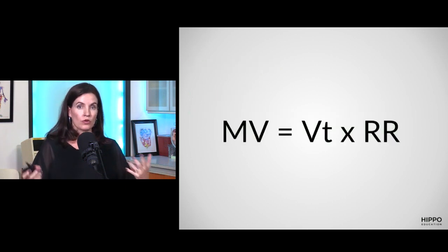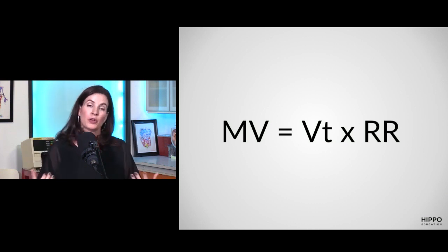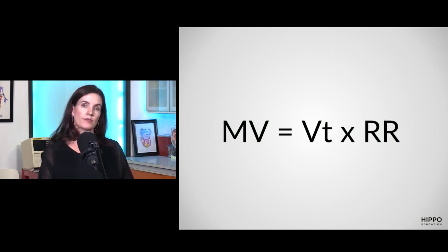Now, the way I remember this is the only formula I'm going to give you. And so if it works for you, you can remember it. But your minute ventilation is tidal volume times respiratory rate. And so when I think of people who need to blow off more CO2, I can remember that they need to increase their minute ventilation, which then cues me to those changes on the ventilator, that those are the two things I can increase to help expand their minute ventilation, which will help them blow off the CO2.